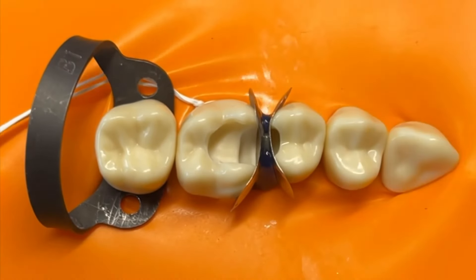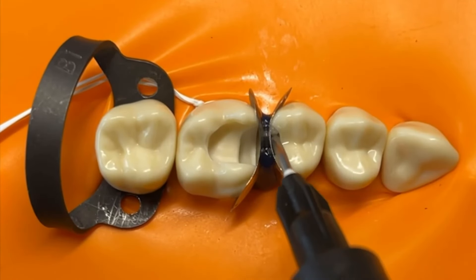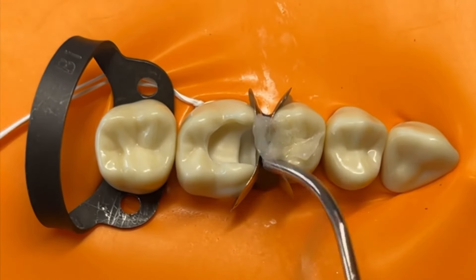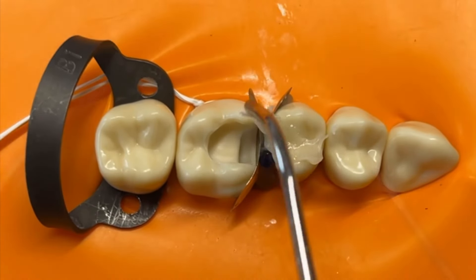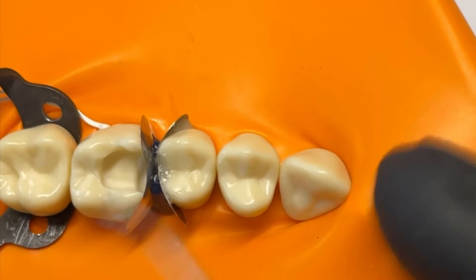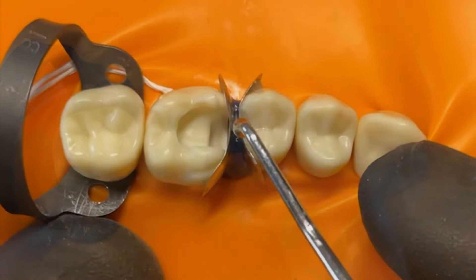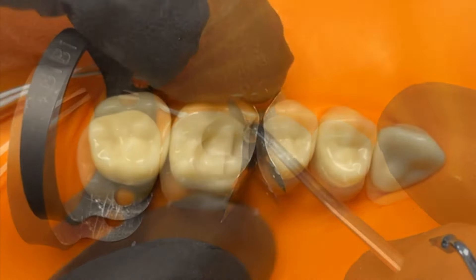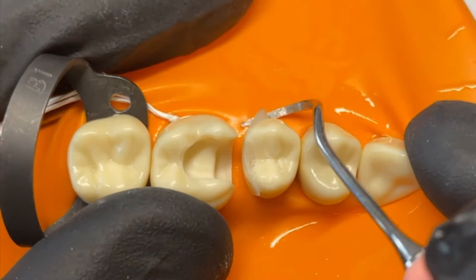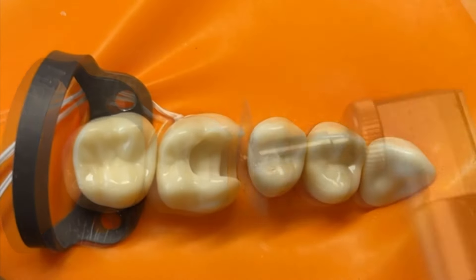To control cervical extrusion and to secure the bands enough to pack against, we do need to secure them — so I'm going to place some liquidam and cure that. I could do this over the wedge, which I would do most of the time, but occasionally without the wedge as well. Now let's restore. I'm going to pick the premolar first — I pick the one I find more difficult. The premolar is more difficult here because it's a small, claustrophobic cavity that I personally find harder to finish, and the opportunity to finish is always better on the first cavity you fill. We then take apart the matrix assembly and have uniquely good access to remove any excess, cure through glycerin, and get rid of the oxygen-inhibited layer.